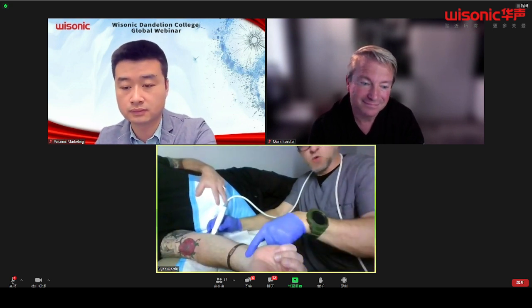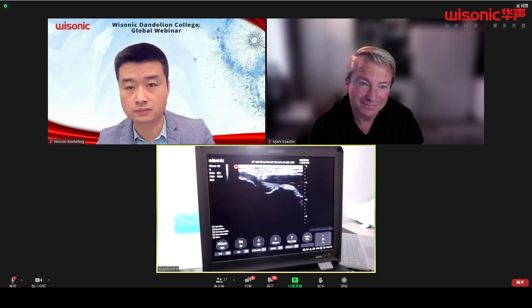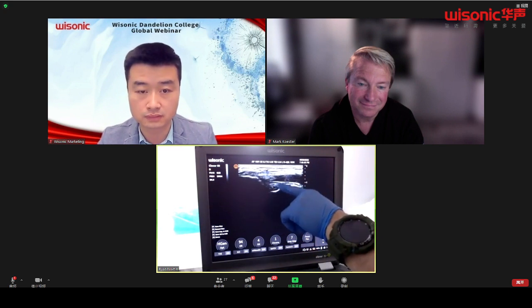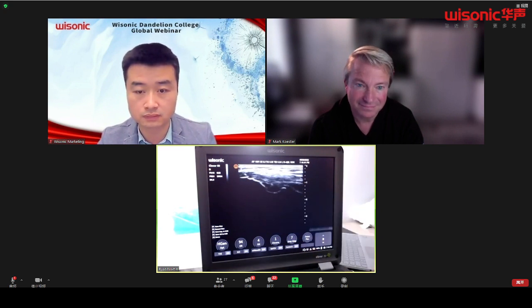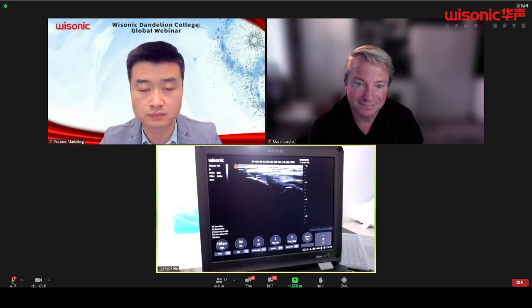Now, once again, we're going to take that probe and we're just going to rotate it ever so slightly towards the carpal row. As we do that, let me show you what it looks like. So now we see that anterior band right here, and I'm rotating that probe. Now that's all tendinous. See this nice tendinous bundle right on top? And that's the common flexor tendon.